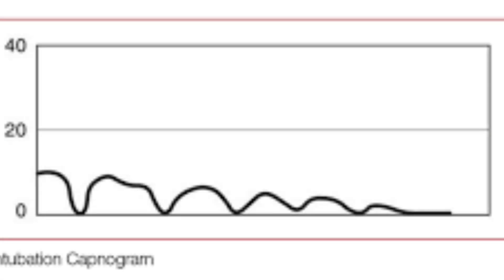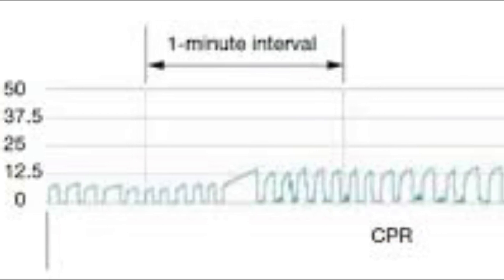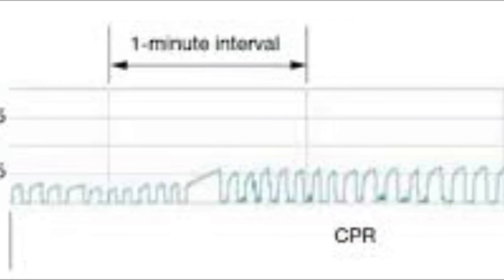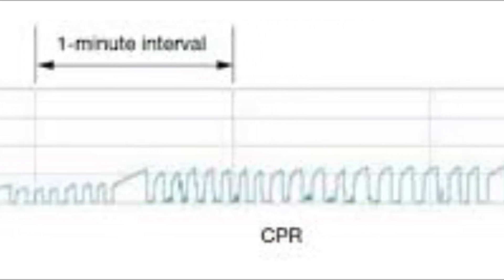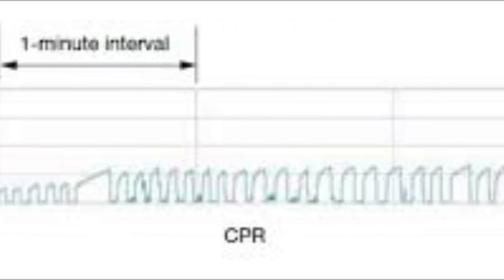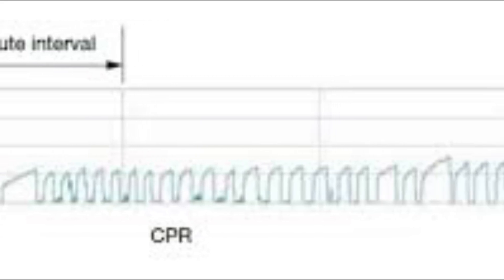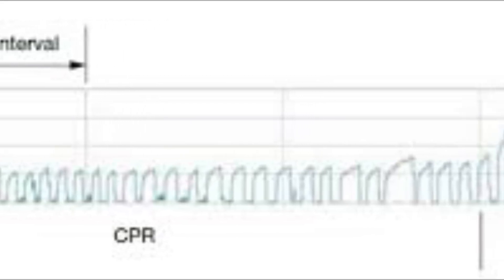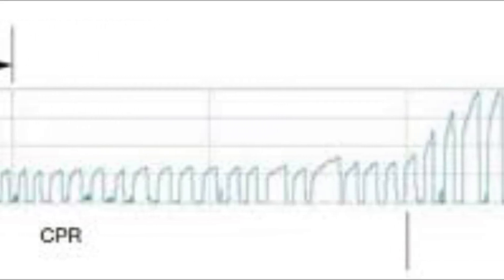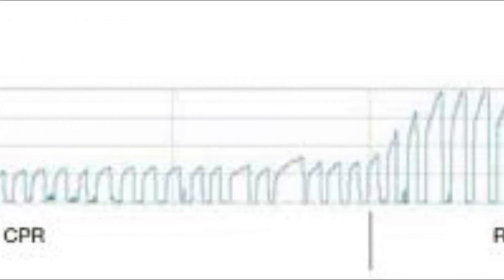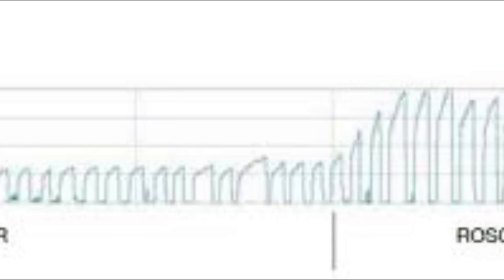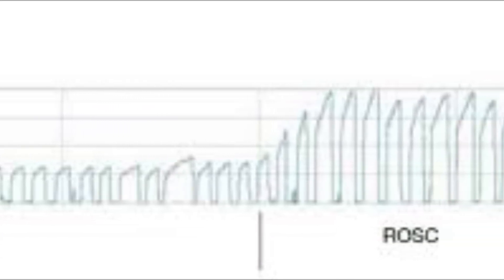When using capnography to verify tube placement, it can also indicate esophageal intubation by showing decreasing numeric numbers and a flattening waveform. During a cardiac arrest, we want a reading of 10 or better. If it's less than 10, it can indicate a prolonged downtime or the need to change compressors.